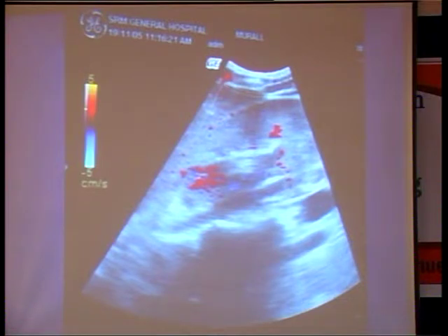That may be one of the causes of brain ischemia. If it is in the lower part, it can go into the heart. That is also possible. So you identify the vessel, whether it is a normal or abnormal vessel, whether the vein is there or not. The flow is also identified. Any thrombosis of the venous system can also be identified.